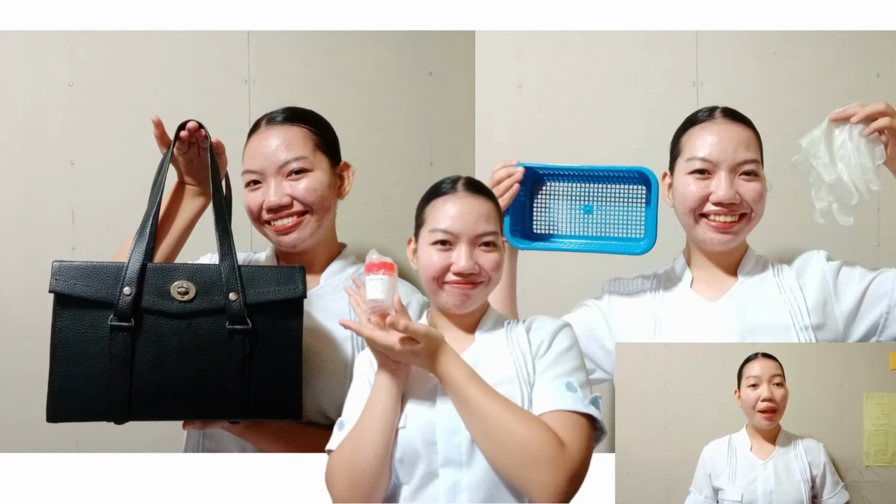For the planning, prepare all the needed equipment and supplies such as the CHN OB bag, the sterile specimen bottle, clean gloves, mask, and goggles, and then the transport container. Prior to performing the procedure, introduce yourself and verify the client's identity using the agency protocol. Explain to the client what you are going to do, why it is necessary, and how he or she can cooperate or participate.